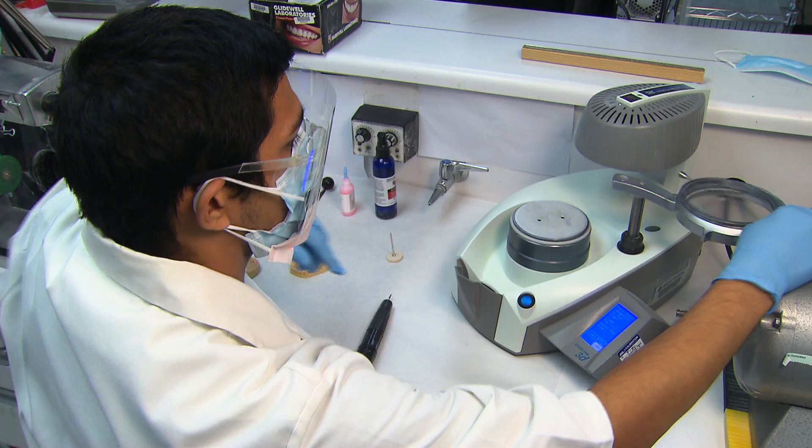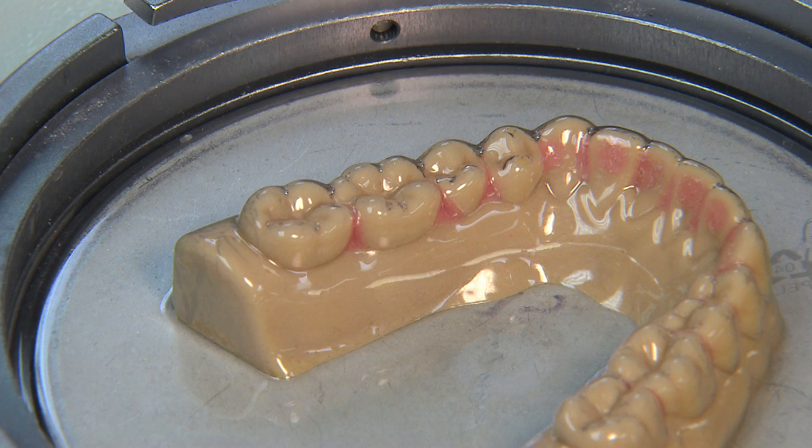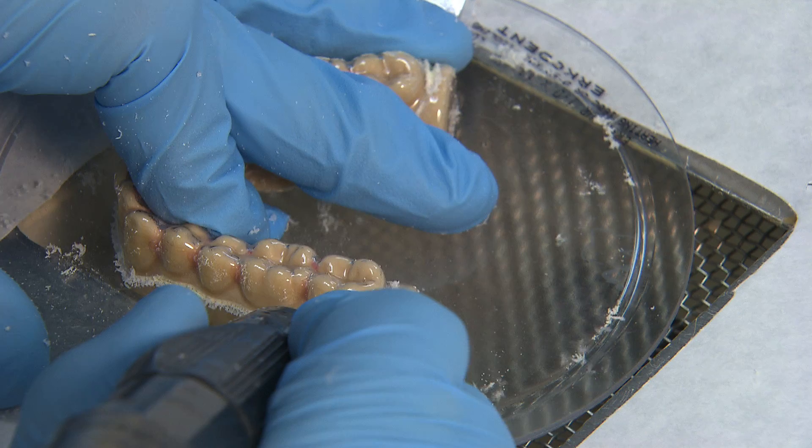An ERCODUR disc is placed into the disc holder and rotated under the heating element. Once the disc is heated to a malleable state, the ERCODUR is vacuumed down onto the stone model. An opposing bite technique isn't required because the material is so thin.